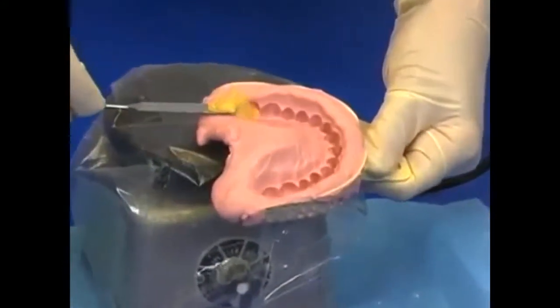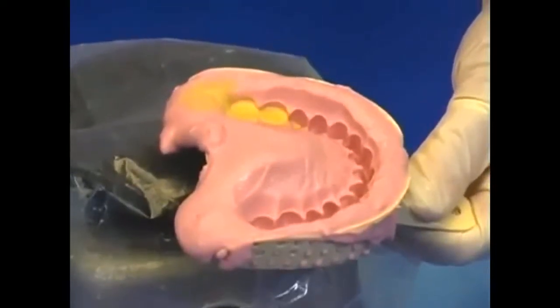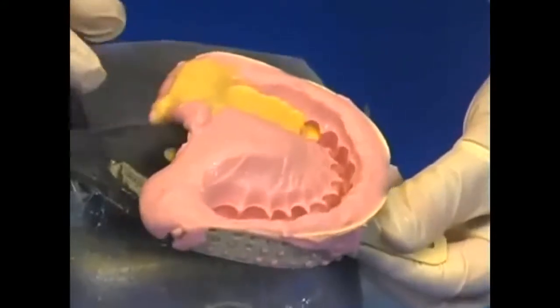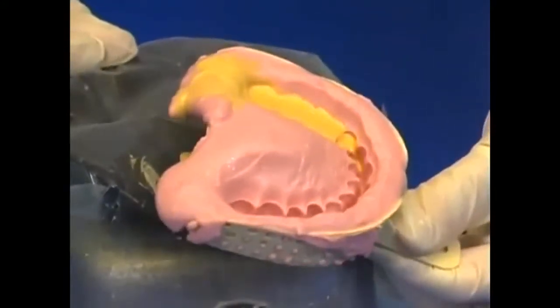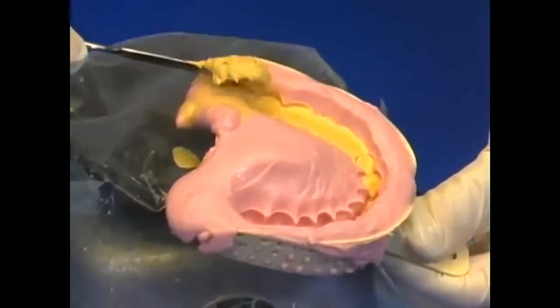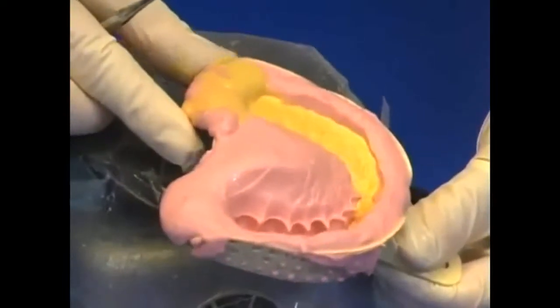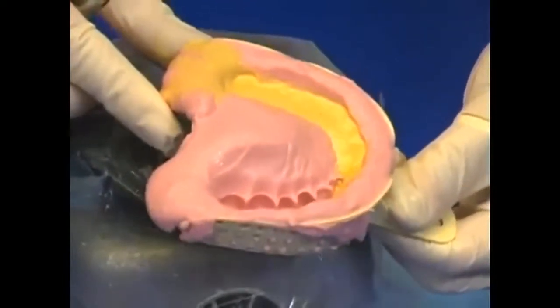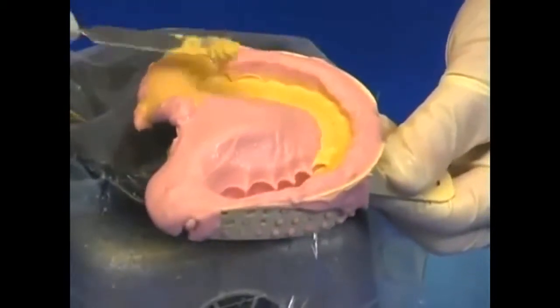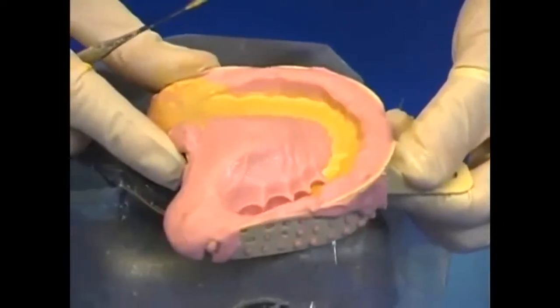Allow the stone to flow into the tooth indentations. Tilt the impression as needed to aid the speed of the flow. Continue adding small increments of stone to the most posterior end of the tray, allowing it to flow anteriorly. Air bubbles will form if the mixture flows too quickly over the tooth indentations.